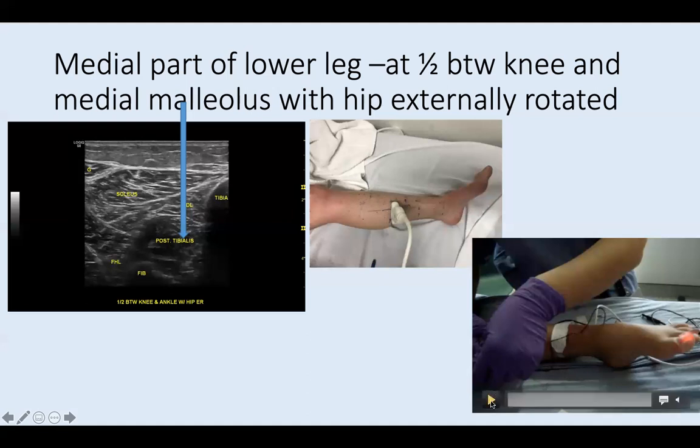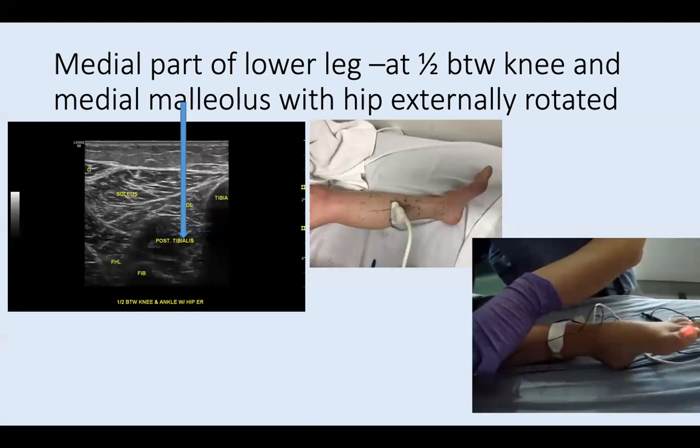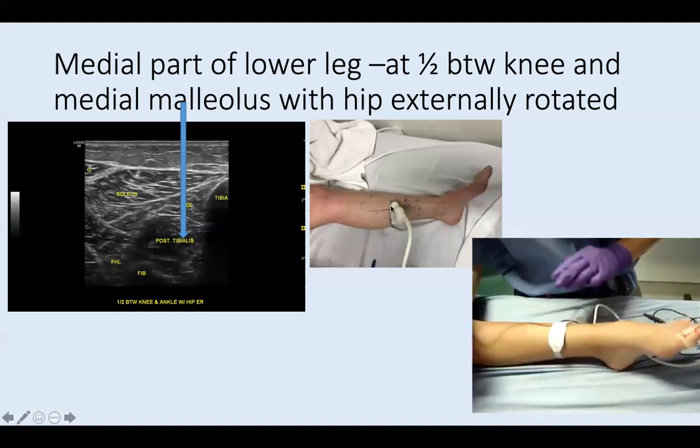And this is the video. I'm doing an injection to posterior tib, plantar flexion inversion. My needle is here. You are seeing my needle was here, right? In the middle, just next to the tibia and straight, parallel with the tibia. Your needle has to be parallel with the tibia: flexor digitorum longus, posterior tib. Don't twist your needle when you put the needle from here. It's going to be out of plane.